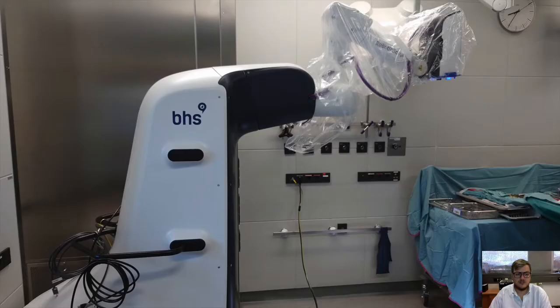Now I would like to show you some videos of our clinical usability evaluation. We did some surgeries with the robotic scope.